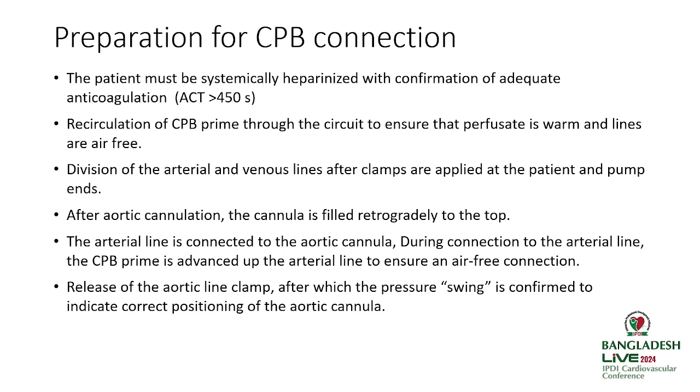So after the connection, we ask him to stop the pump, and then we take out the clamp on the aortic cannula and ask him to check how the swing is, whether the cannula has passed actually into the lumen of the aorta.